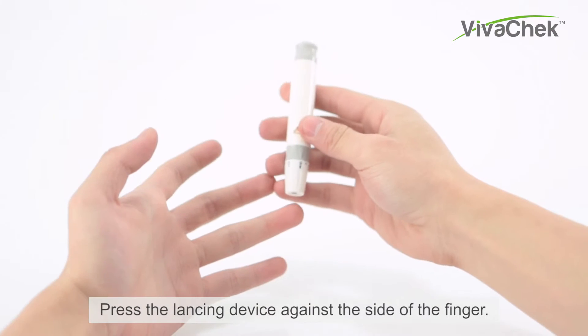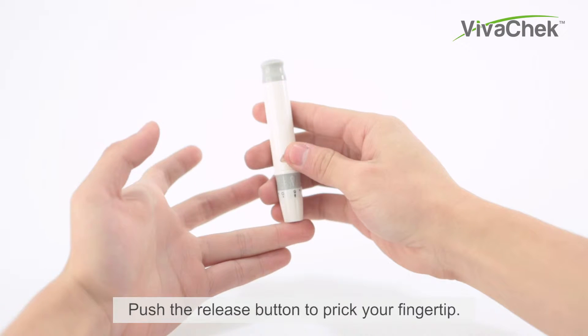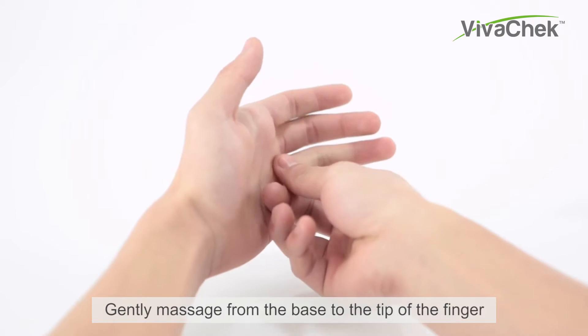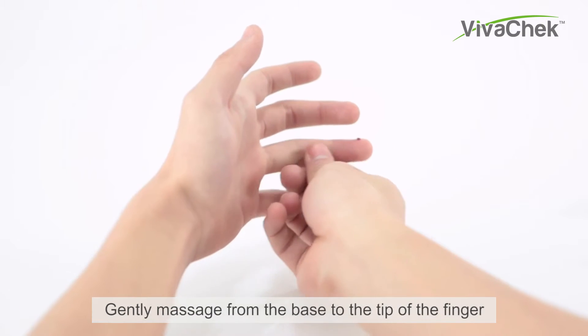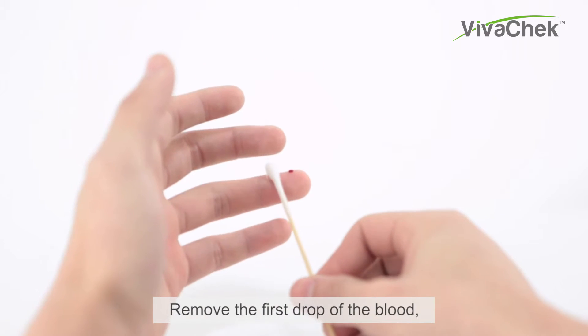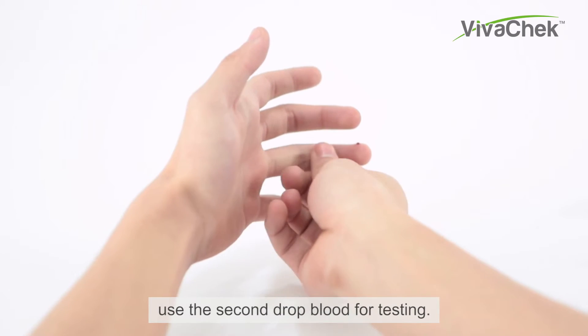Pull the cocking barrel back until the release button changes to orange color. Press the lancing device against the side of the finger and push the release button to prick your fingertip. Gently massage from the base to the tip of the finger to obtain the required blood volume. Remove the first drop of blood and use the second drop for testing.